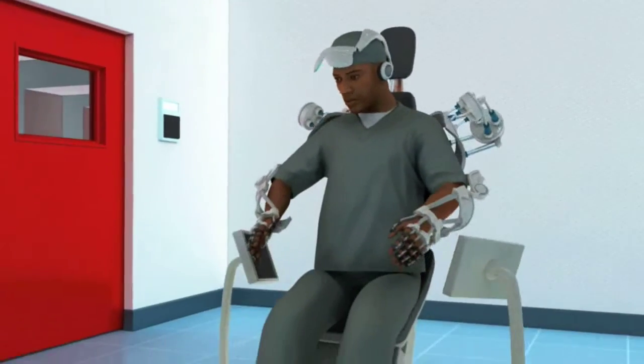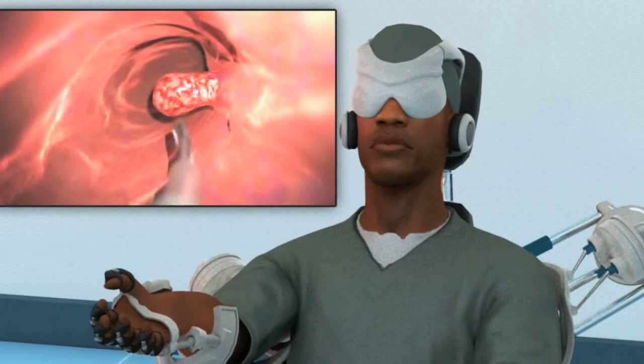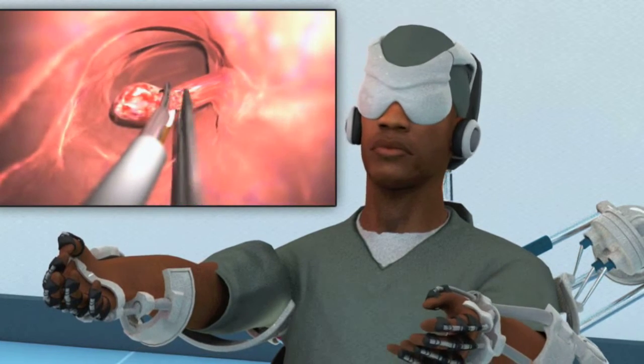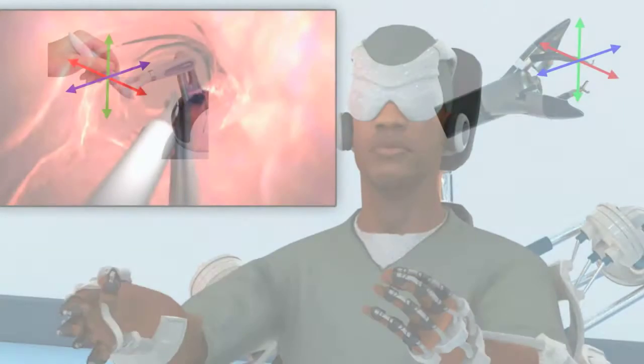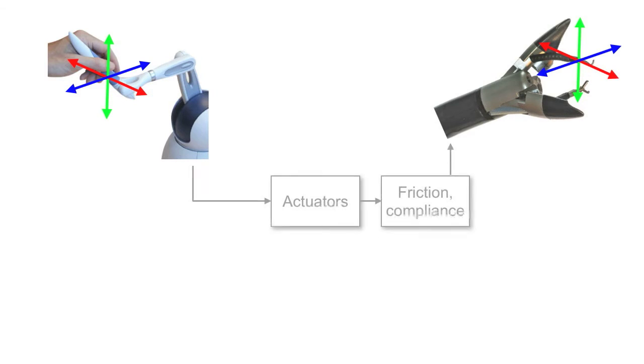A solution to this problem would be to build a teleoperated system in which a single physician can control the endoscope and all instruments from a single surgical console. This would allow intuitive control of the entire intervention. Thus, the goal is to actuate the endoscopic instrument so as to follow the movements of the input device, which is operated by the physician.